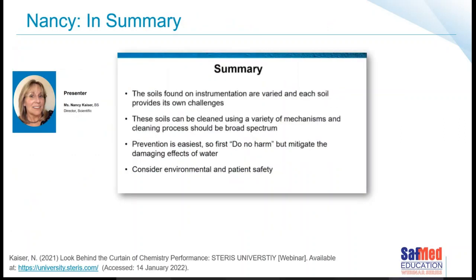Nancy, in summary, said that the soils found in instruments are varied, and each soil provides its own challenges. These soils can be cleaned using a variety of mechanisms and cleaning processes, and they should all be a broad spectrum cleaning process. Prevention is easiest, so you really don't want to do any harm and you want to mitigate the damaging effects of water itself. And always remember products that are environmentally friendly, and of course, patient safety is of utmost importance.